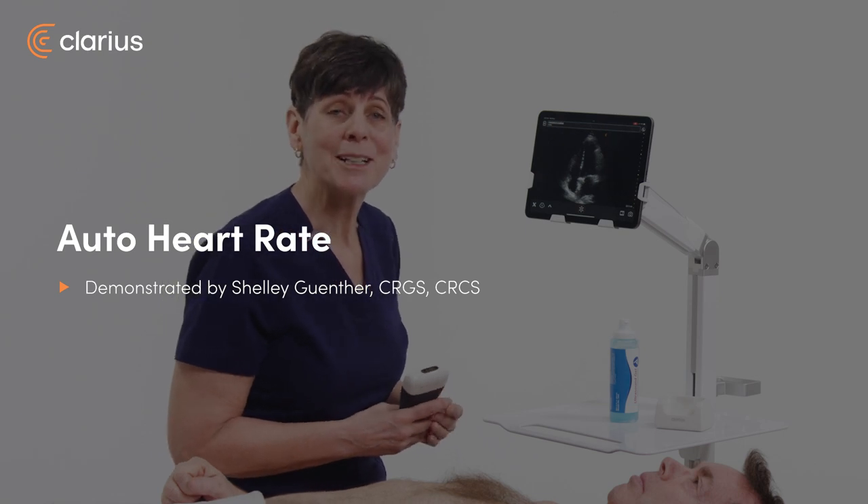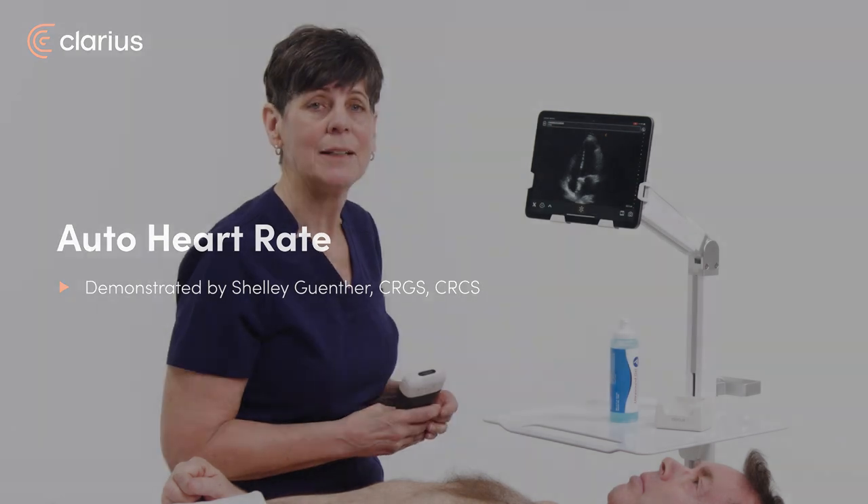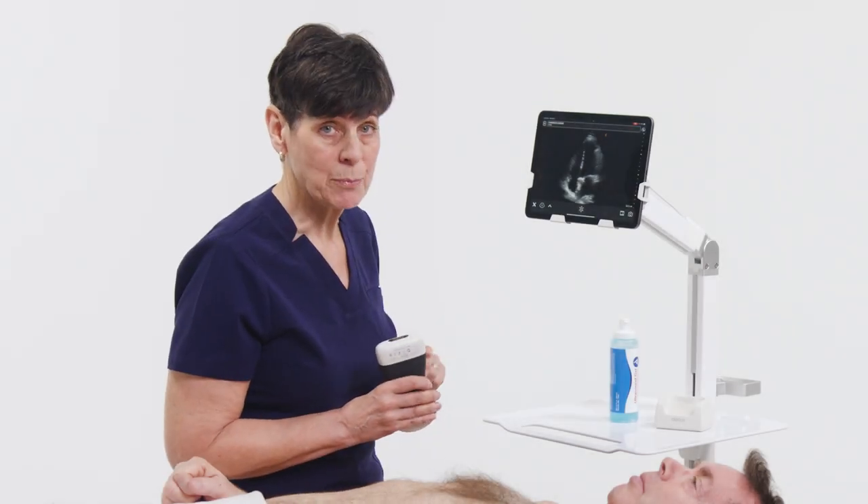Hi, my name is Shelley, and today I'm going to tell you about a feature called Auto Heart Rate on the Clarius app. Now for Clarius scanners with the Cardiac preset — so that includes the C3, the C7, and the PA — you can obtain heart rate information even without an ECG.